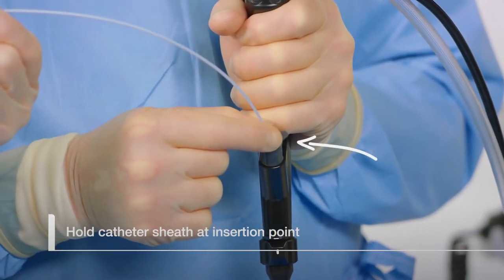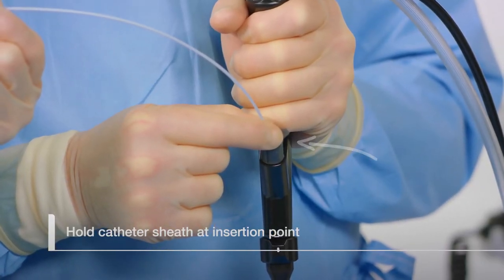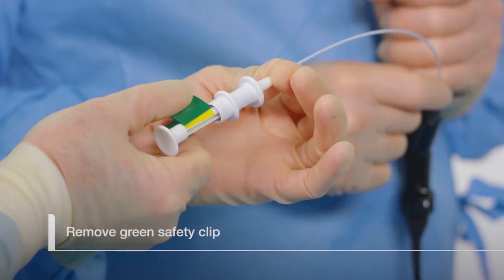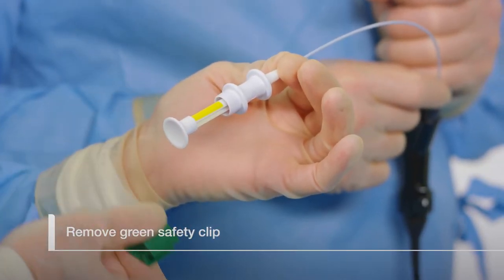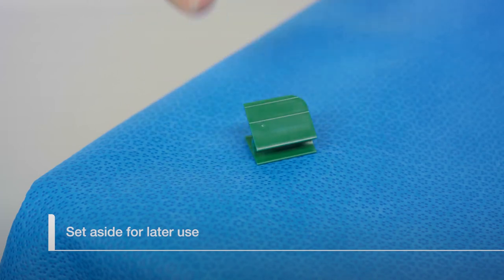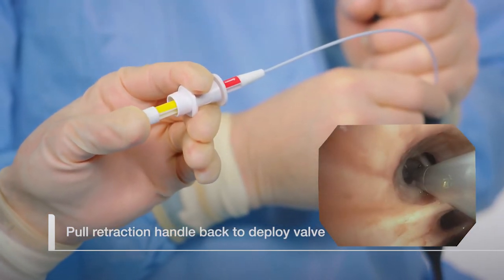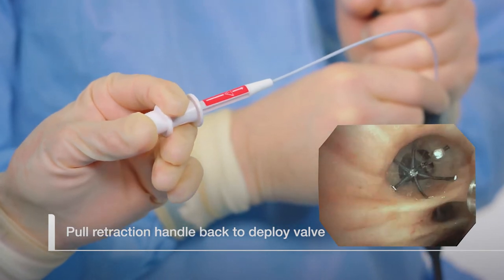Hold the catheter sheath at the instrument channel entry port and remove the green safety clip. Set the safety clip aside for later use. Using a smooth, continuous motion, pull on the catheter retractor to deploy the valve.